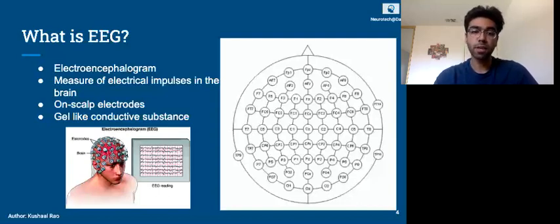However, let's say we have this baseline recording of them just sitting there, and then you suddenly show them something and you see a spike. Well, that's an event-related potential. The name makes sense because it's an electrical potential that is related to an event that has just occurred. These event-related potentials are a result of direct sensory, cognitive, or motor events, and that is exactly what we study when we use an EEG system and look at electroencephalography.